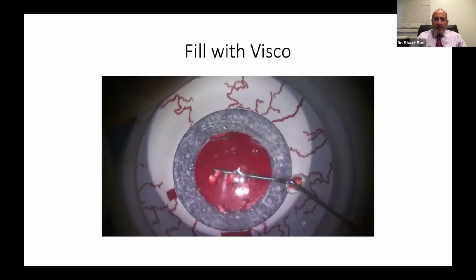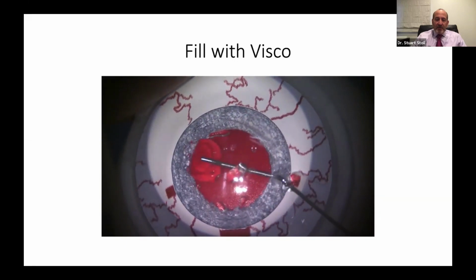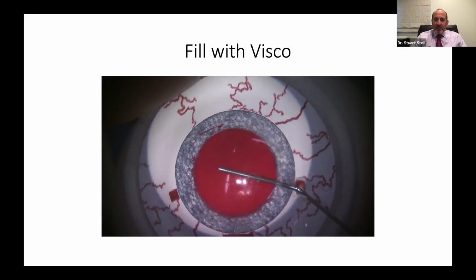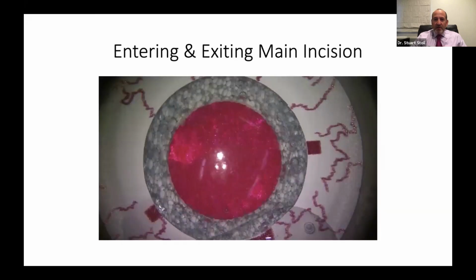On another attempt, I might go from the right-hand paracentesis. You're going to create these paracenteses. You're going to practice making those incisions and filling the eyes using different hands, coming at different angles. And look, we haven't even touched the eye yet. We haven't used it. We can just keep going in and out and doing these things.